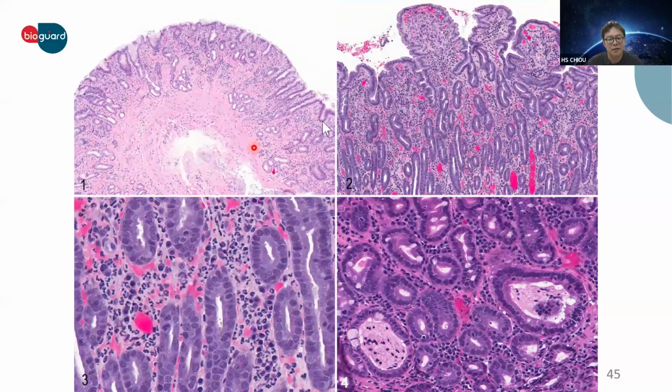Now let's look at some actual histological examples from a dog with IBD. From figure 1, the stomach, specifically the antrum. Here, within the lamina propria, you can see multifocal glandular atrophy. Normal glands are reduced, and in their place, we see fibrosis. This is not just inflammation. This is structural remodeling, such as chronicity.